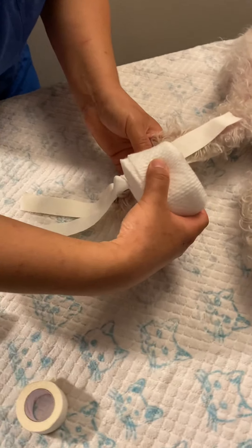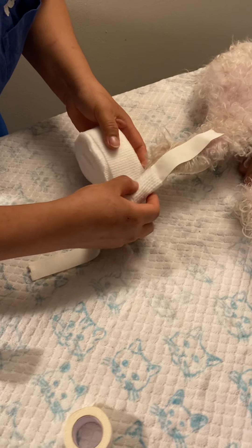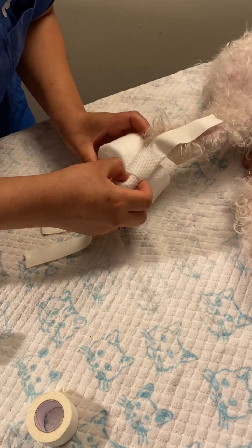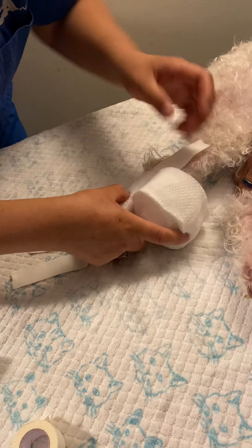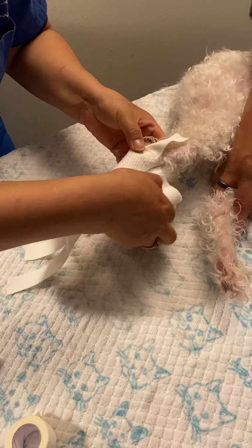We don't want to compress anything from the top. We're going to try to go evenly by 50% overlap around her leg — not too tight. She has a pretty small leg so they're basically overlapping by half. We're going to do two rows, going all the way up and all the way down.